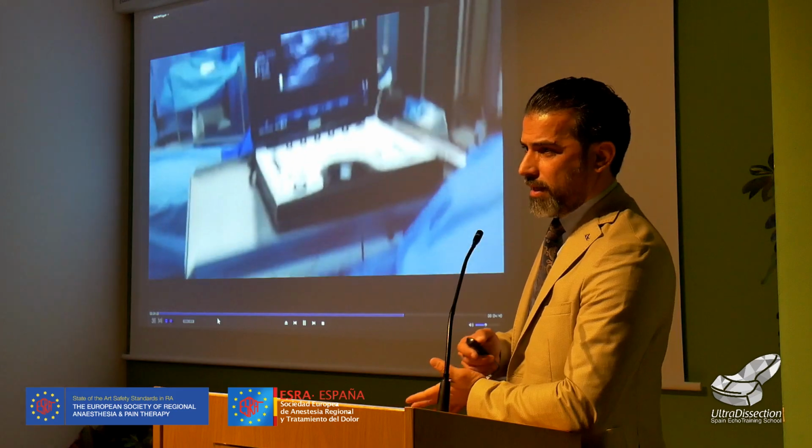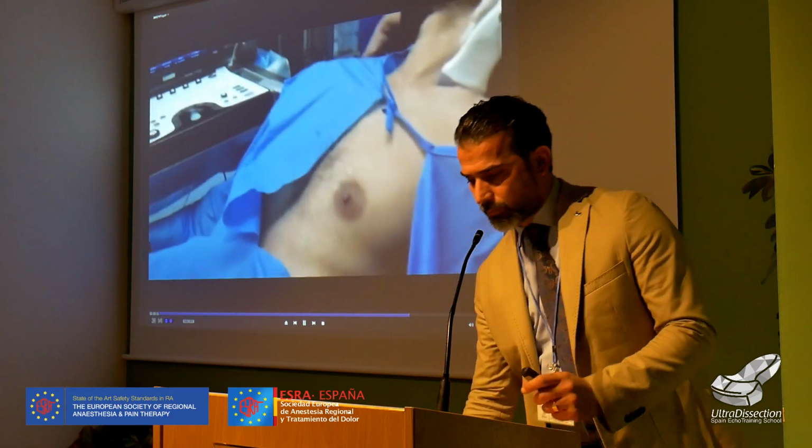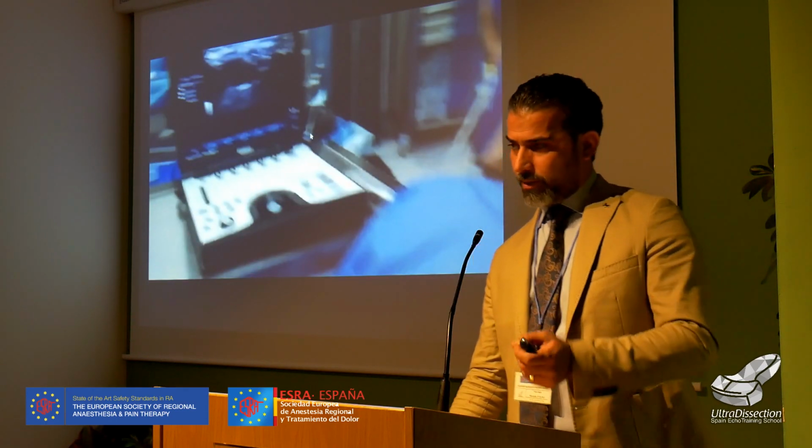So this is the C8, T1, T2. I will show you another video about how to do injection around the cervical root.